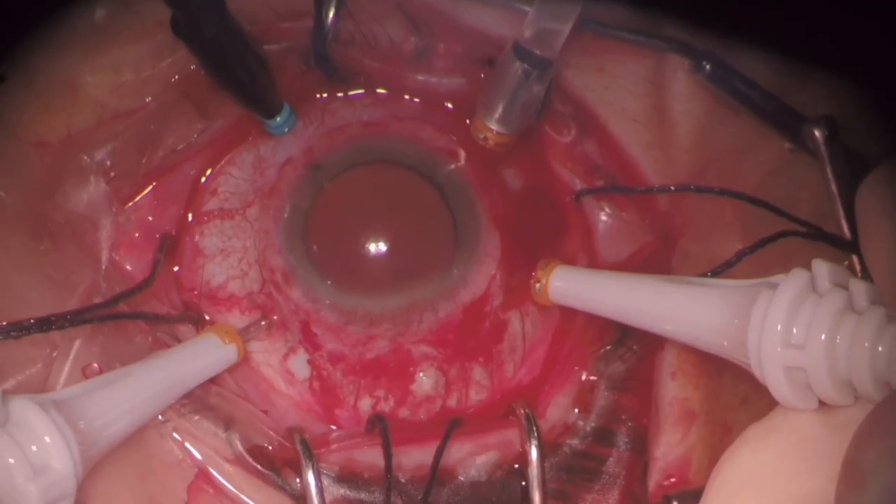At this time, the surgery was converted to pars plana vitrectomy with a 23-gauge system. The surgeon performs core vitrectomy, induces the PVD, removes the retinal break flaps, and tries to assess whether local aspiration can mobilize some of the subretinal blood. Then he places a perfluorocarbon bubble trying to push the subretinal hemorrhage to a region outside of the macula, but the blood was already clotted and did not move.